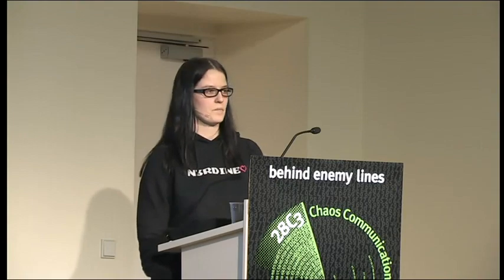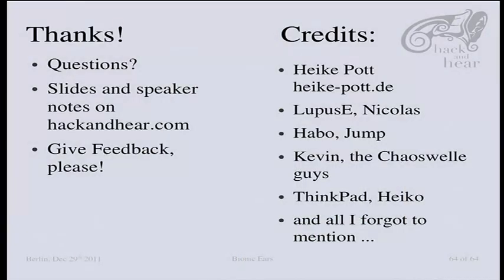Any more questions? Hello. I would like to add two things to your wish list. One thing I would like the hacker community to find out is what the real differences are in devices from different price ranges, what is done in hardware and what is actually only firmware. My audiologist reported devices coming back from repairs or failed programming reporting as more expensive devices, for instance, so it's just a firmware thing.